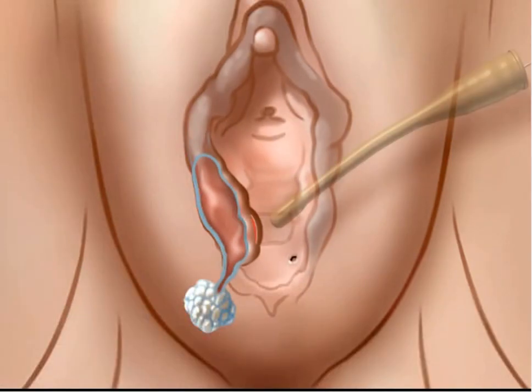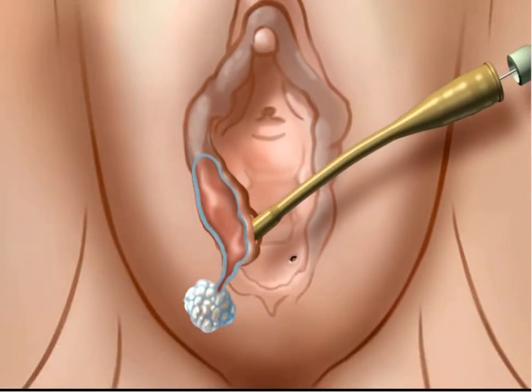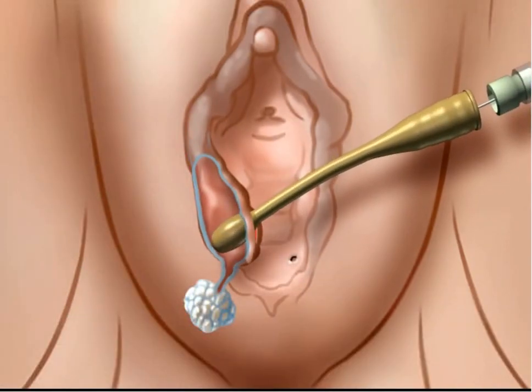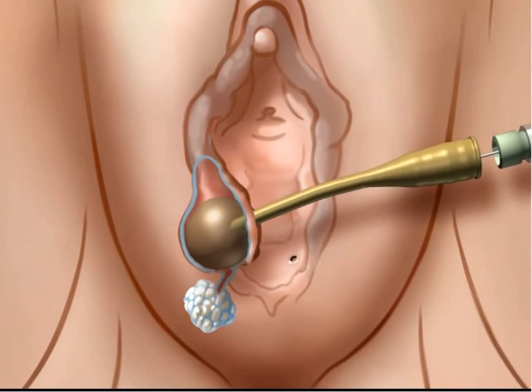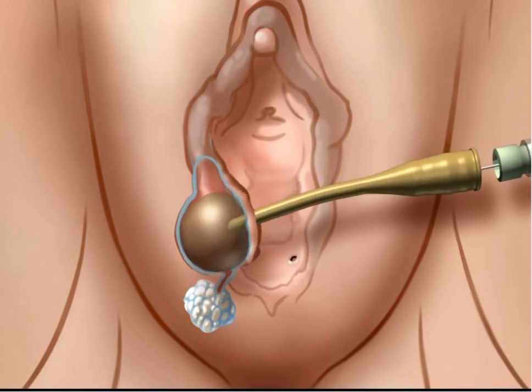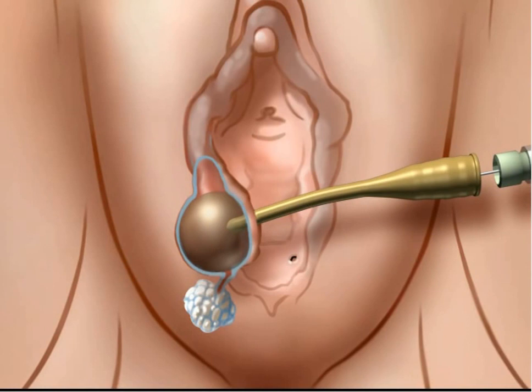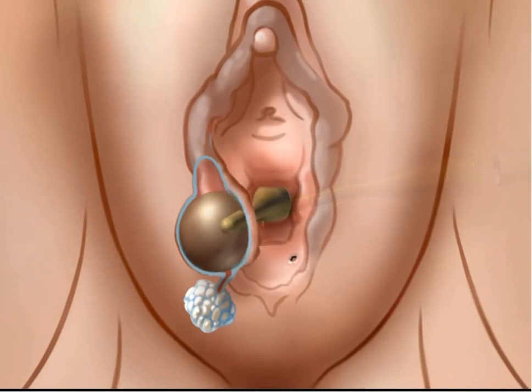The tip of a deflated word catheter is placed within the empty cyst cavity. A syringe is used to inject 2 to 3 cc's of sterile saline through the catheter port to inflate the balloon. The balloon is inflated to a diameter that will prohibit the catheter from falling out of the incision. The injection port of the word catheter can then be tucked inside the vagina, preventing the balloon from being pulled out by traction from labial movement.